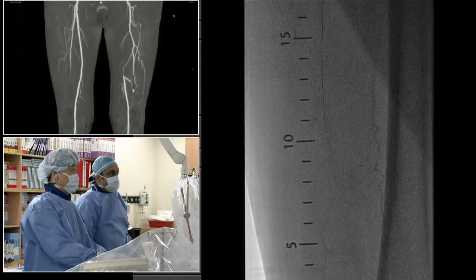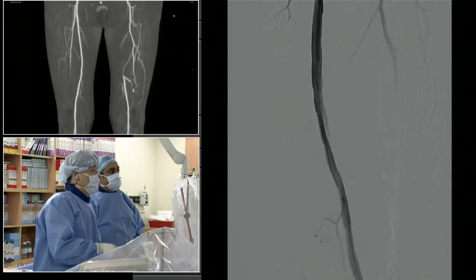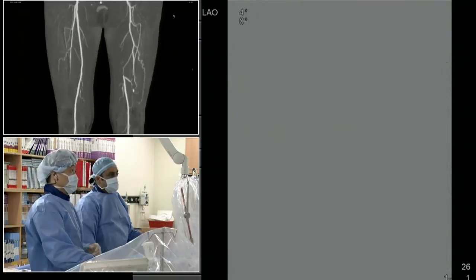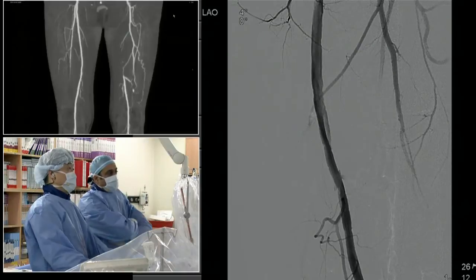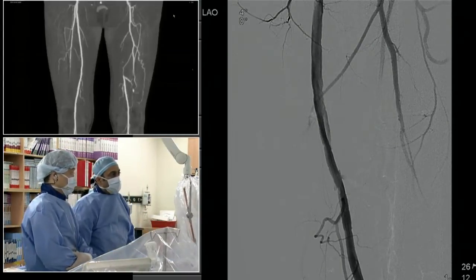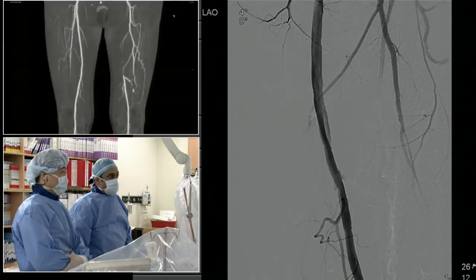One great advantage of using atherectomy, specifically the Silverhawk, at the origin of the SFA is that you don't get the plaque shift that you would have gotten with other technologies. So we see this little area. I went to a little higher mag here at the distal reentry point because there was some concern there, and there does appear to be a small dissection, maybe about 15 millimeters linear. Thoughts of the panel on what to do with this, if anything?